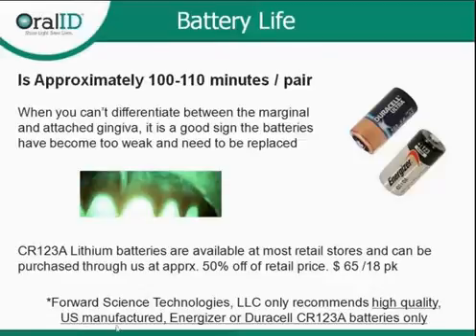You do need to use a U.S. manufactured brand, which is either Energizer or Duracell. If you use a non-U.S. manufactured brand, we can't promise something wouldn't happen to the device and that it wouldn't affect the warranty. These are the two that have been tested and FDA approved for use.